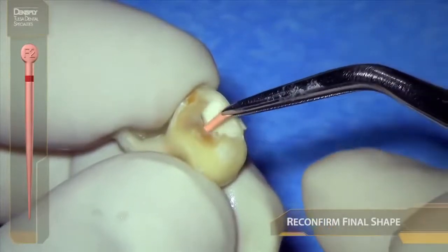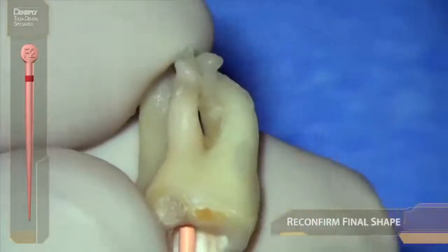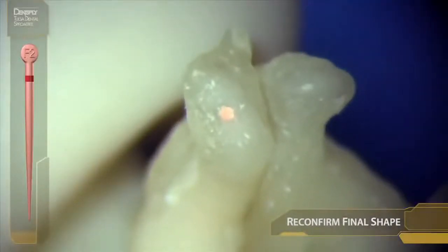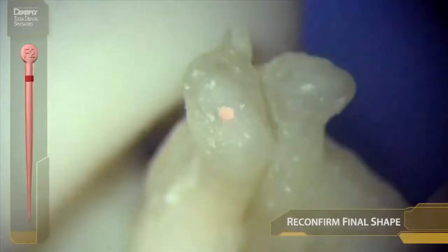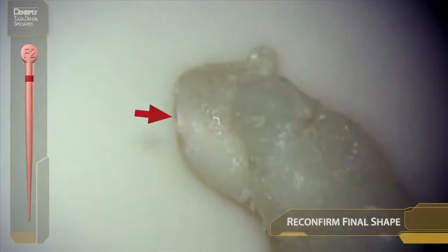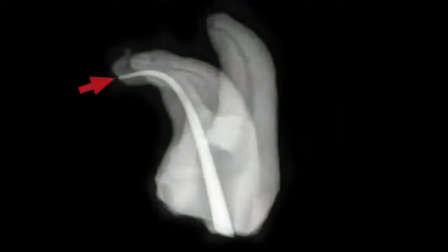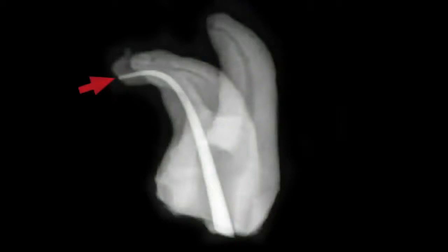We can do the same thing with a verifier in a carrier-based obturation, designed for vertical compaction of warm gutta percha. Clinically, we can observe that the position of the gutta percha cone fit — round peg into a square hole — is exactly where the original foramen was. From the side, we would see radiographically that the cone fits exactly at the radiographic terminus.